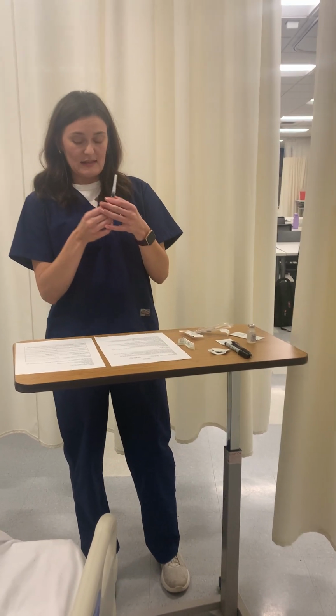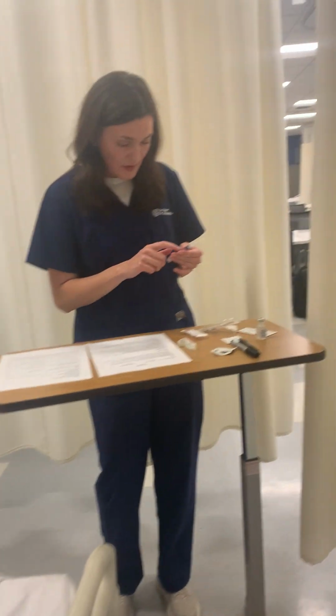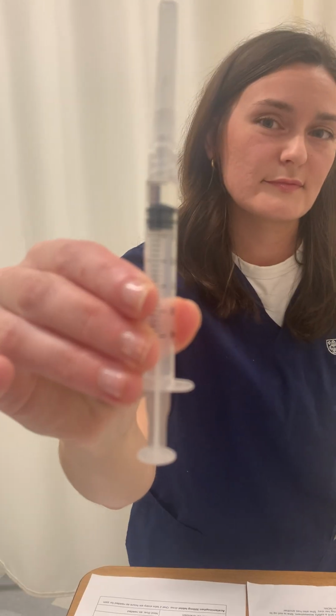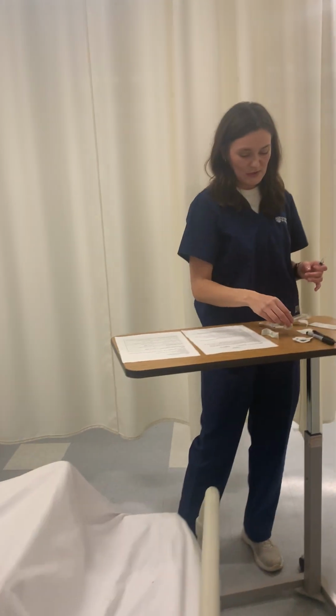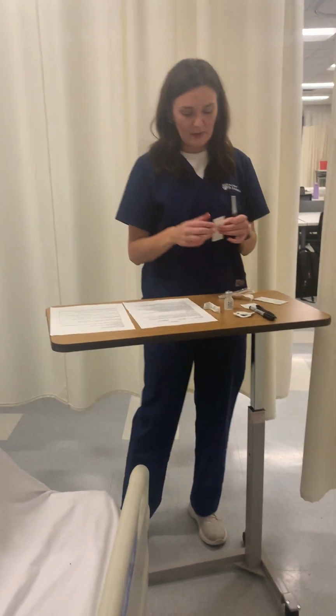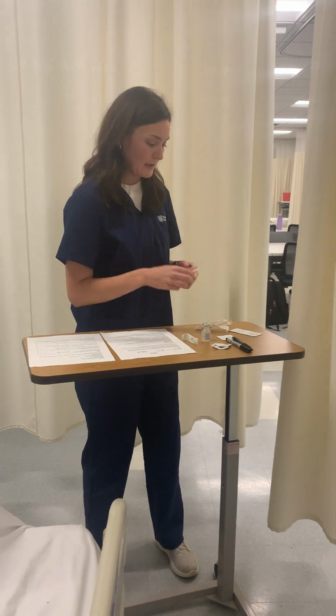Just bring this in the room and put it on. So if you want to look at this, I have 0.5 mils. So if you'd like to look, 0.5 mils of Fluzone. Okay, so I've done my 2 med checks. I'm going to bring my needle in there with me since my sharps bin is in the client's room.